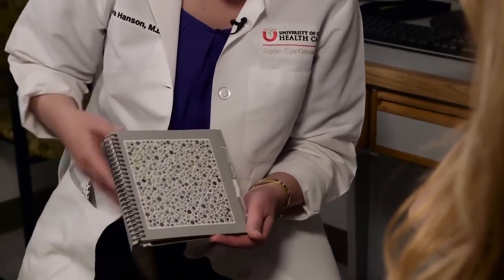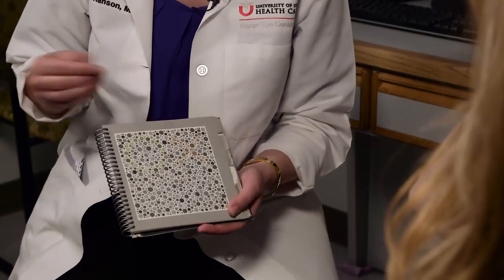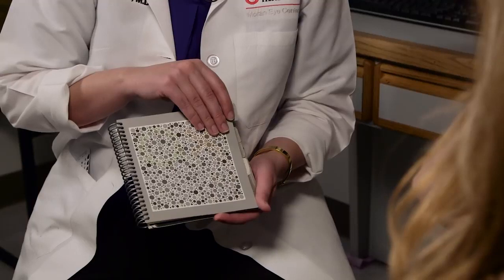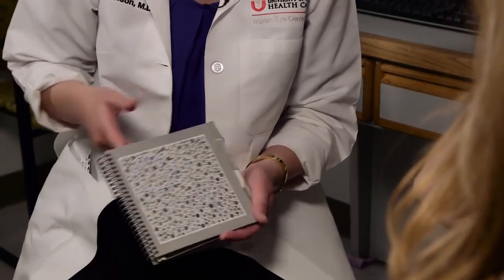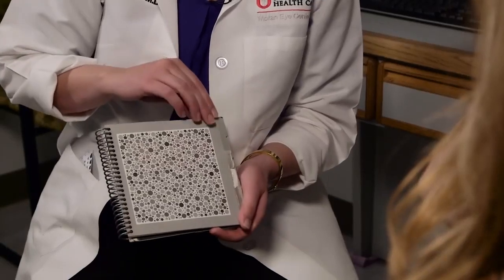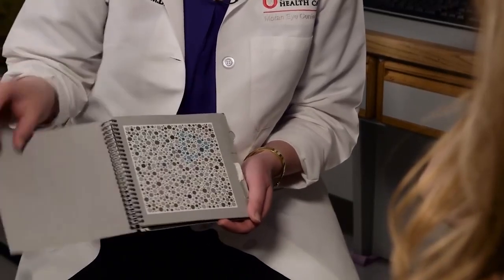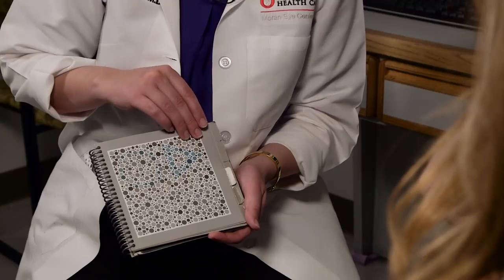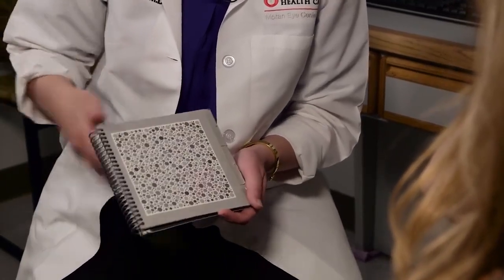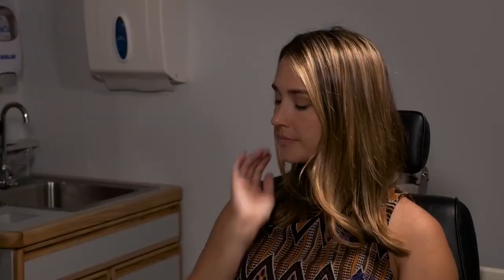And then the next 6 plates are the screening test. And so again, you have the patient test one eye at a time, and ask them to go through each of the plates. O, X. Just a 0. X, triangle. O, triangle. O. X. Very good. And then you can do the same thing with the other eye.